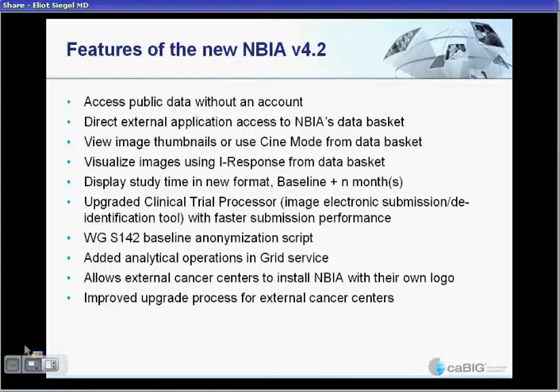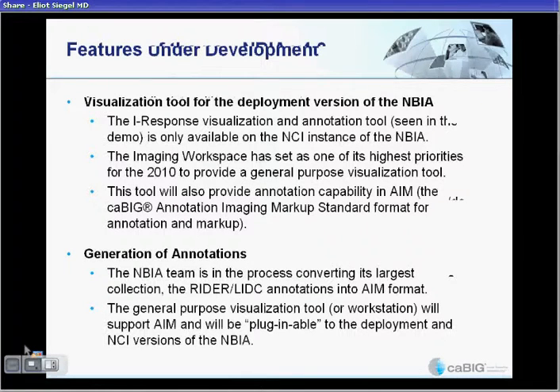There's also an upgrade to the clinical trial processor with much faster submission process. And so there's software that we have at NCI that was developed by the RSNA that is specifically designed to facilitate the submission of images from a PAC system or a modality across and through firewalls, and to de-identify that information and to be able to send it to a server.